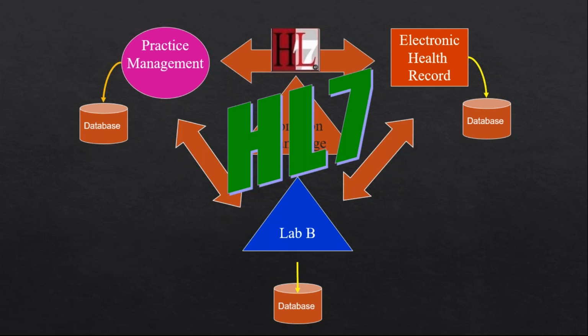So we will see how HL7 standards are developed, how HL7 has been created, and how an HL7 message has been created in the next few slides.